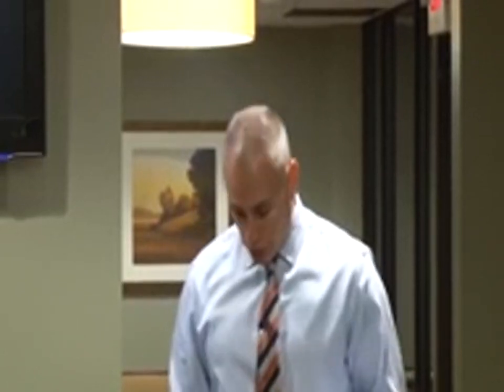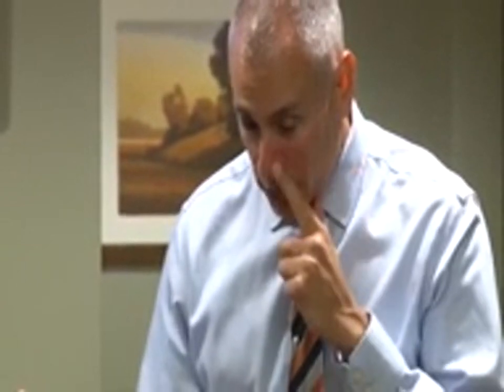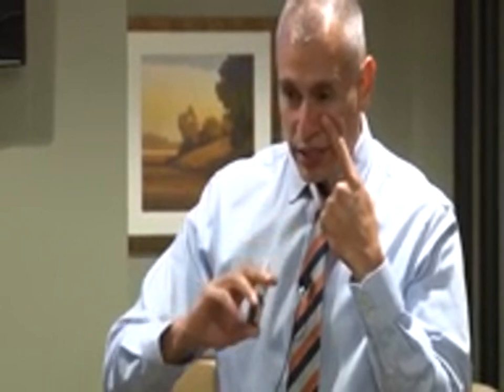Okay, and the proper way to spray this in is to put your head down like this, pull your nostril out with one hand. So my left nostril, I'm going to spray with my right hand, but I'm pulling my nostril out with my left finger, okay?